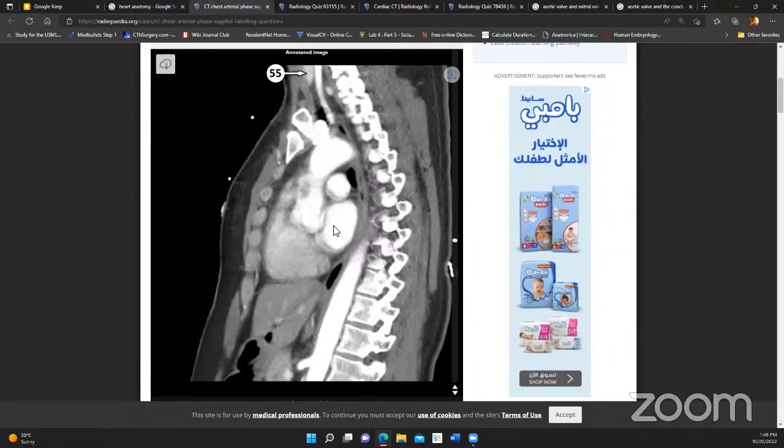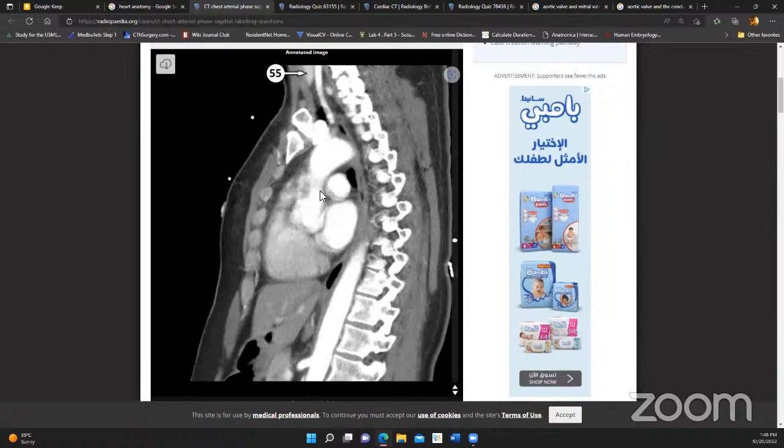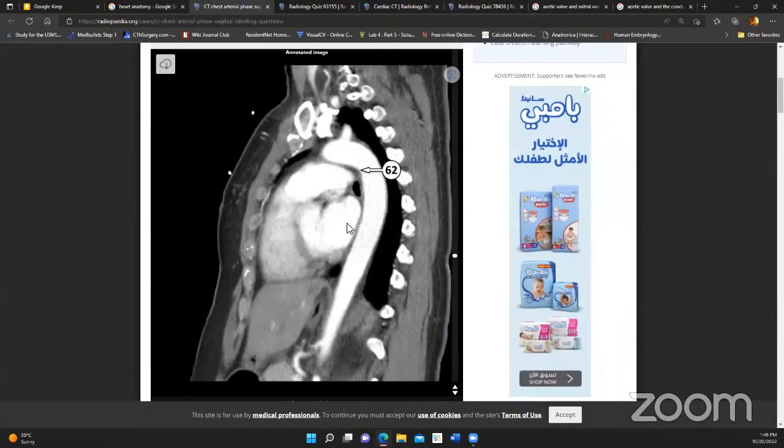And then the LV goes back into the left atrium. You can see the left atrium, and this is the aorta. If you put the cross clamp across the aorta, you can either perforate this pulmonary artery or catch the left atrial appendage. Is what I'm saying clear, or am I making it more difficult or complex?